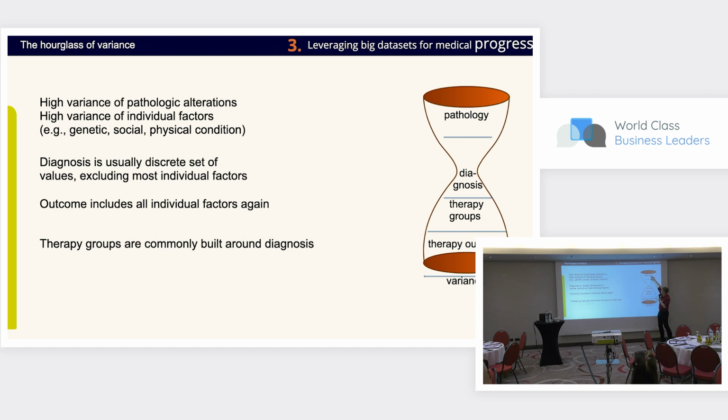However, this means that from here to there, we're already grouping. So we're already putting groups together. This is not reflecting the fact that these are still different pathologies here. They're just grouped now. And of course, the outcome here will be noisy. So it means that in some cases it works, in other cases it doesn't work. Why? We don't know, because we have actually thrown the information already away when grouping.